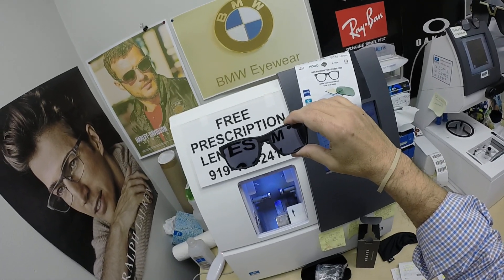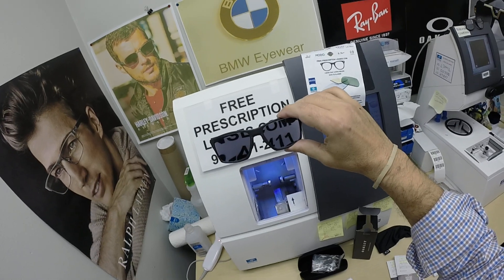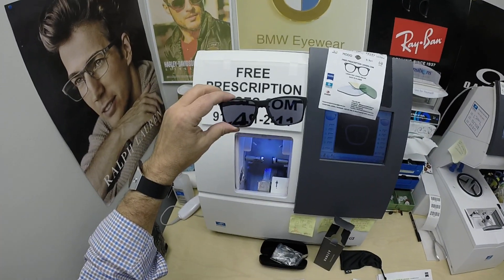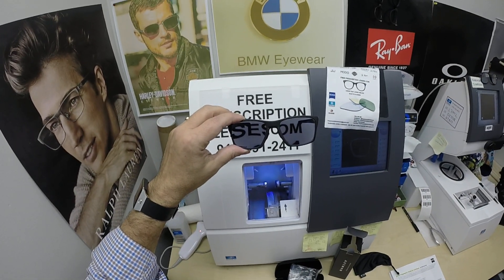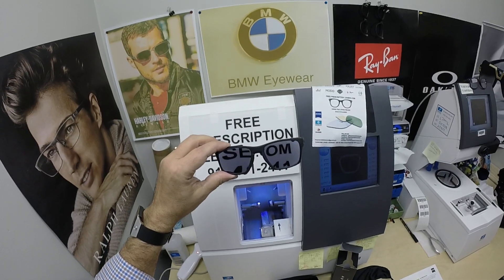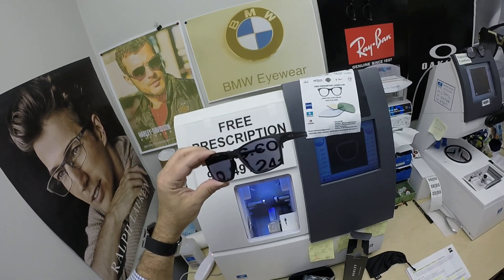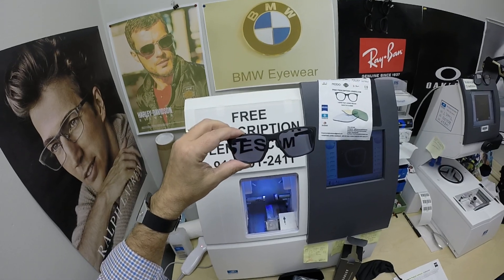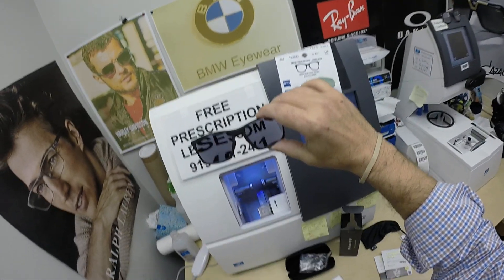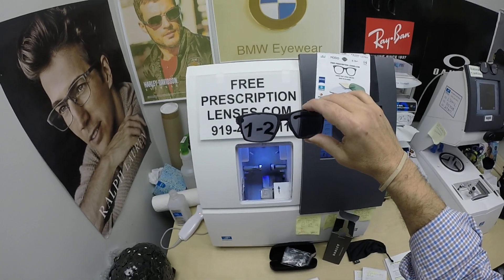Now the other nice thing about photochromic lenses — they were the original blue blocking lenses. The regular Zeiss photo fusion blocks 30 to 50% of the harmful blue light emitted from today's electronic devices, such as cell phones, tablets, computer screens, and such. Don's photo fusion extra gray will block 50 to 70% of the harmful blue light.